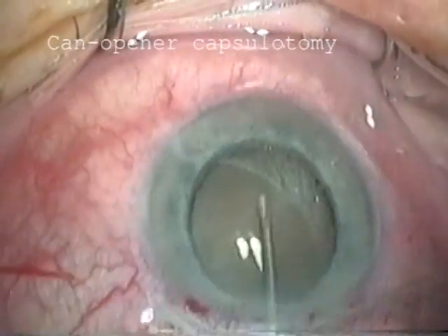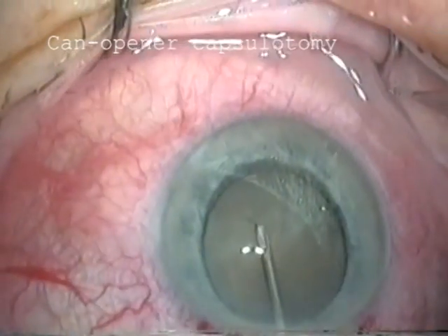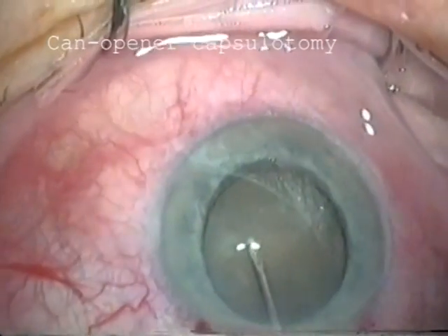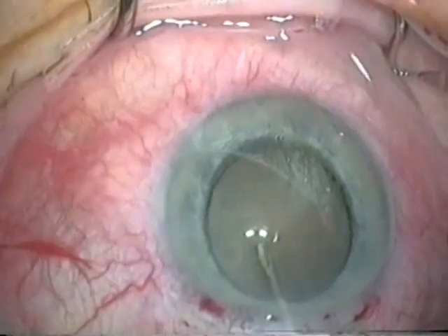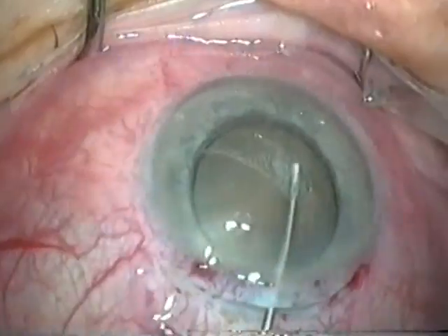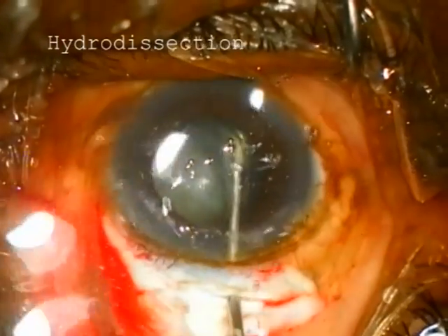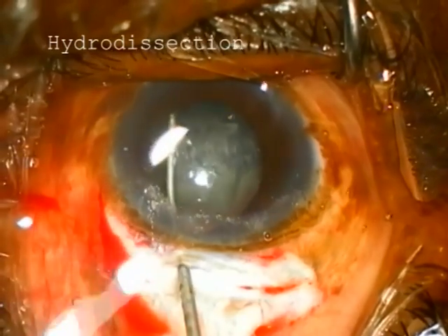This is called can-opener capsulotomy. It's best to start at the lower end of the pupil. Fluid is injected under the capsule using a blunt cannula to separate the nucleus from the cortex and to help mobilise it.